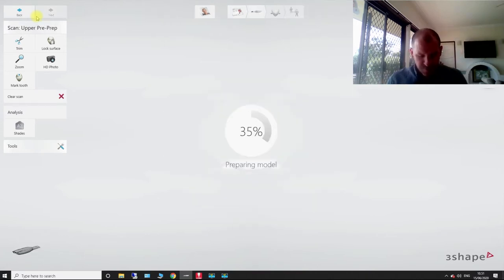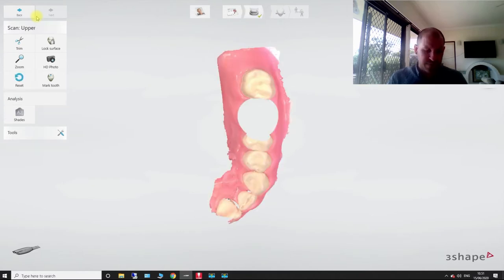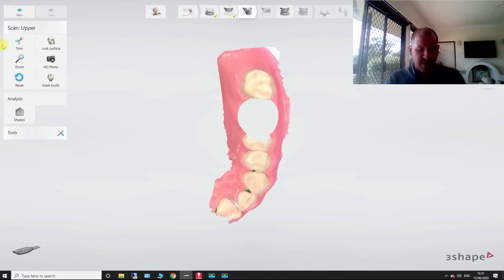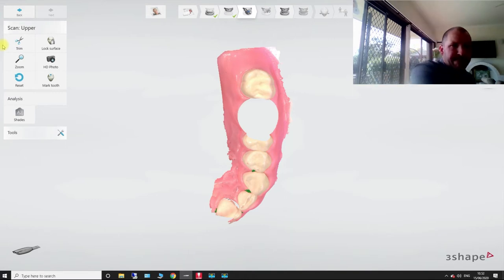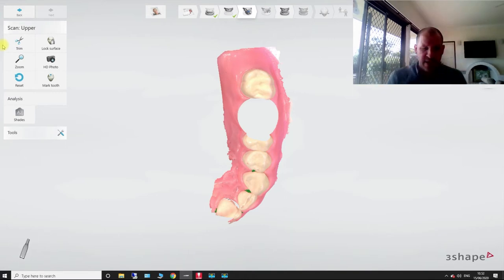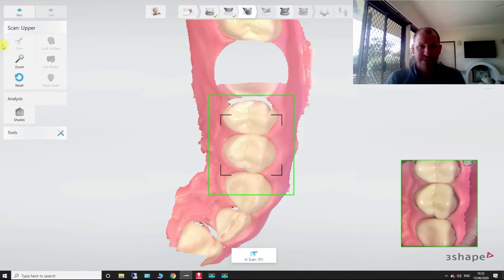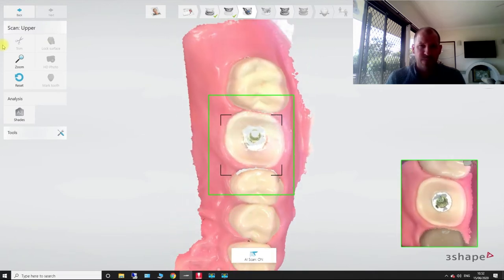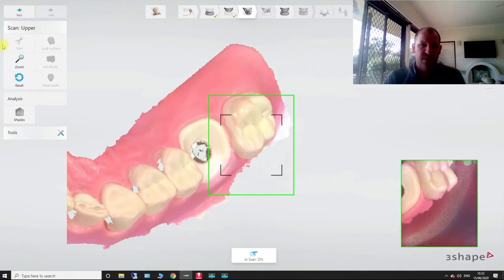So you add in the pre-preparation scan. And then once you've chosen your implant and everything like that. So now healing cap is going to come out. And now what we're going to do, we're scanning in this part just down in here.